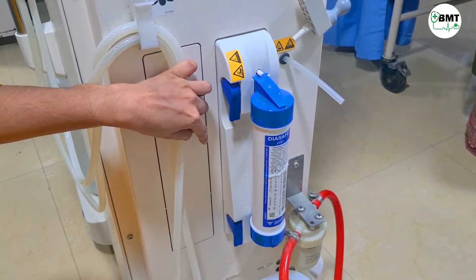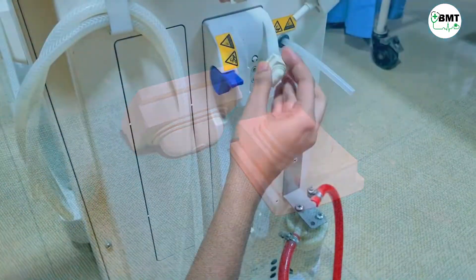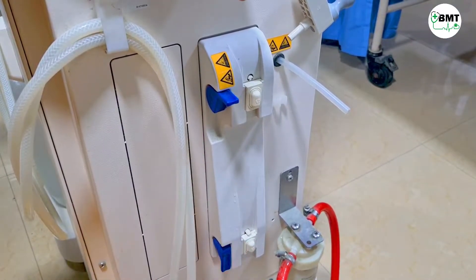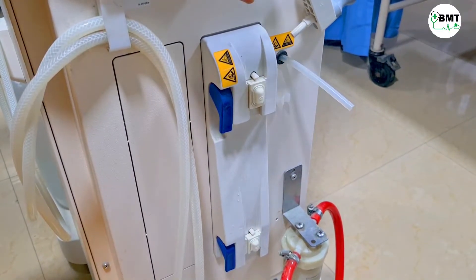Close. In case you do not have a filter, then you can use these blockers in the meantime. Just place this over here and close. Then the water alarm will not come.